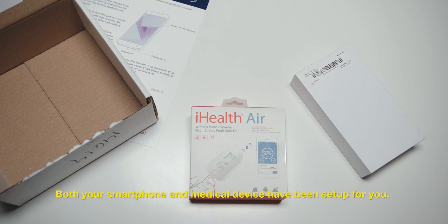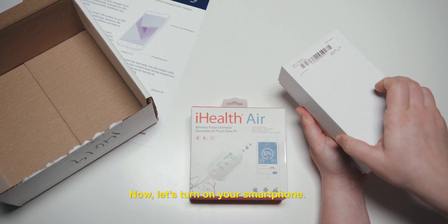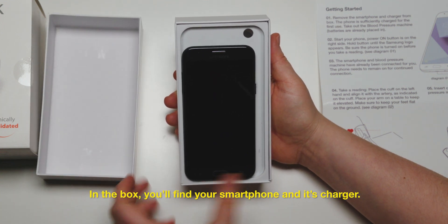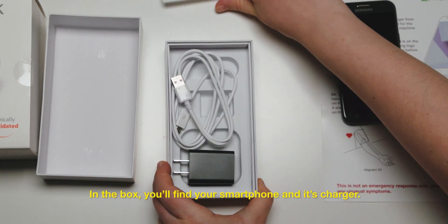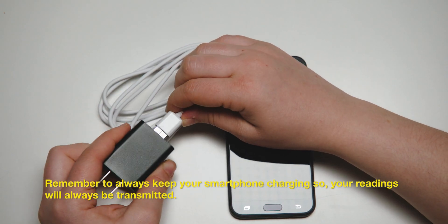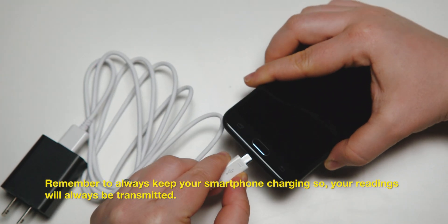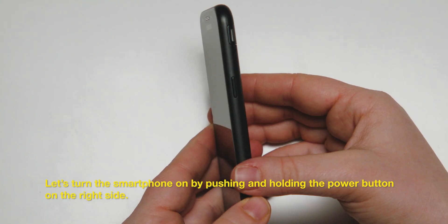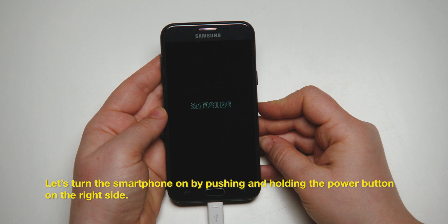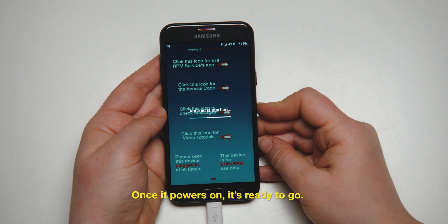Both your smartphone and medical device have been set up for you. Now let's turn on your smartphone. You'll find your smartphone and its charger in the box. Remember to always keep your smartphone charging so your readings will always be transmitted. Turn the smartphone on by pushing and holding the power button on the right side. Your phone may take a minute to power on. Once it powers on, it's ready to go.